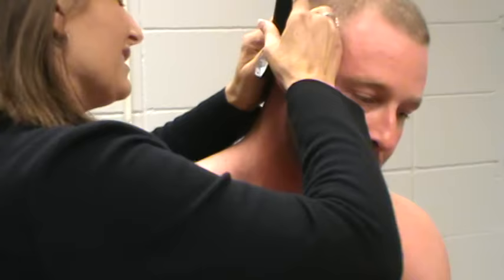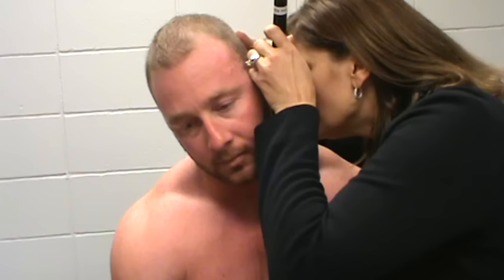Okay. Now I want to look at the inside of your ears with this otoscope. What I need you to do for me is, if you will, tilt your head slightly to the side. There we go. Okay. I'm going to pull up and back. Pearly gray, absolutely beautiful. Okay, now we're going to look at this other side, so if you'll just tilt to the other side for me. I'll pull up and back again. There it is. Okay.